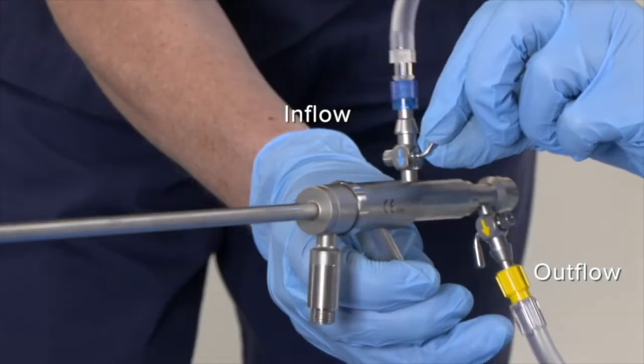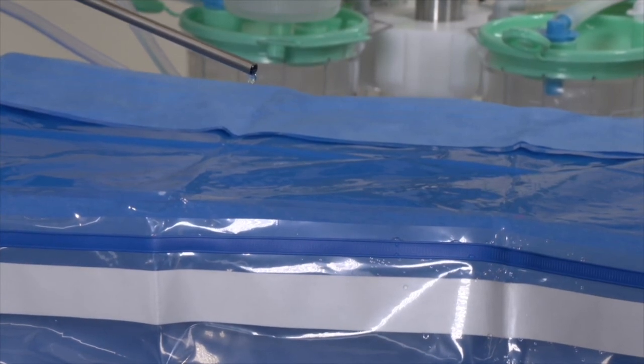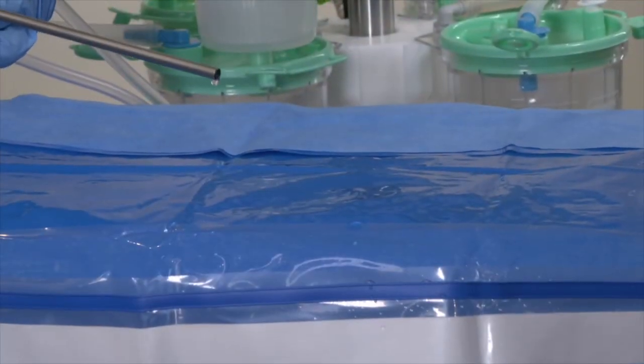Open both inflow and outflow stopcocks on the scope. Point the tip of the scope into the underbuttock drape in line with the axes of the uterus. Press the prime button to start priming the system. Saline will be pumped through the scope at various speeds to calibrate for approximately 20 seconds.